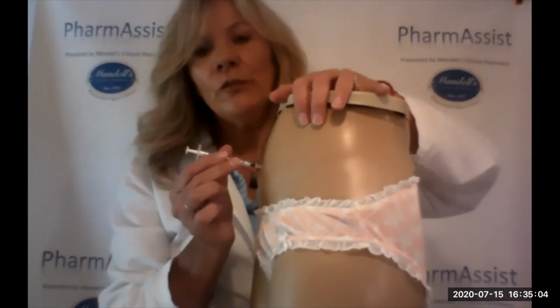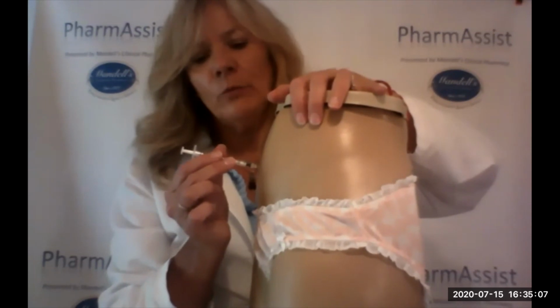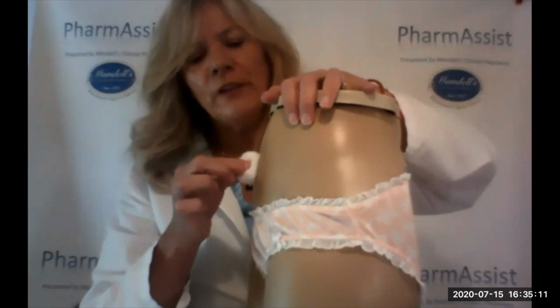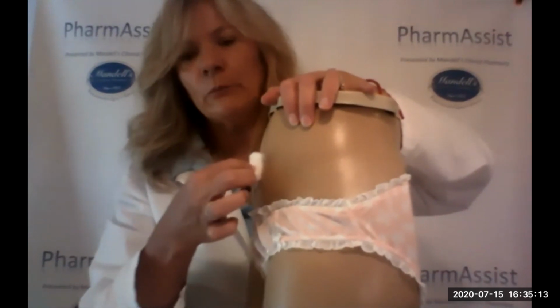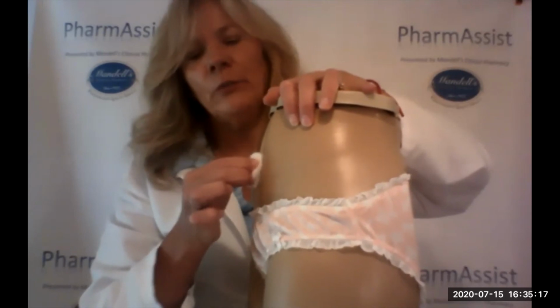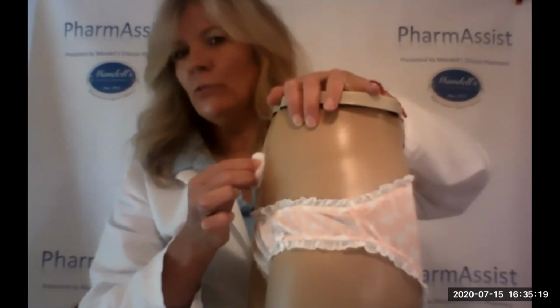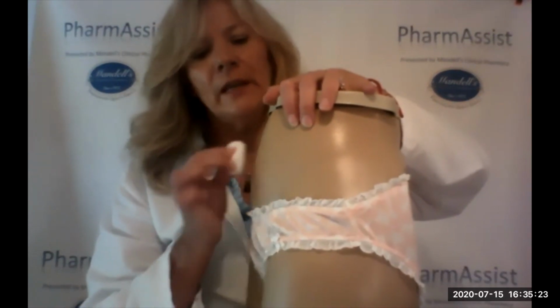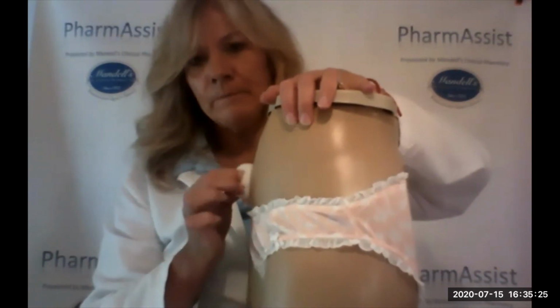And then when you remove the needle, you can do a little 1, 2, 3 count, move it gently, set it down, and then you'll put a little pressure there, just to, if there's any fluid that's moving, you want to keep it in the skin for it to absorb. And you also want to stop any little bleeding. But usually, like a mosquito bite, you might get a little bleeding from these little tiny shots, but not much at all.